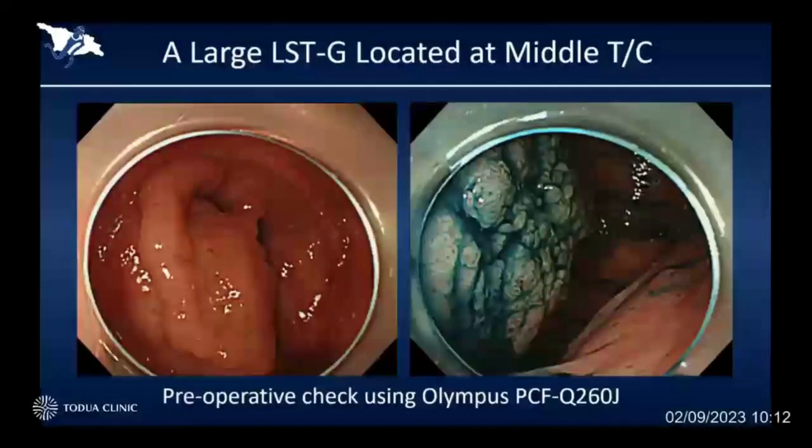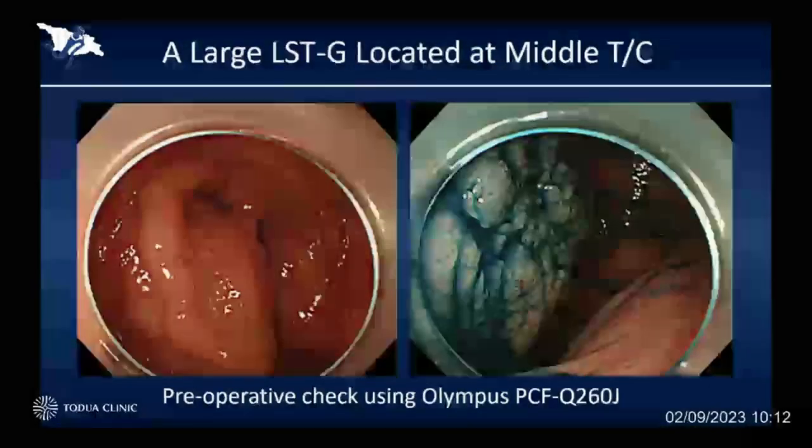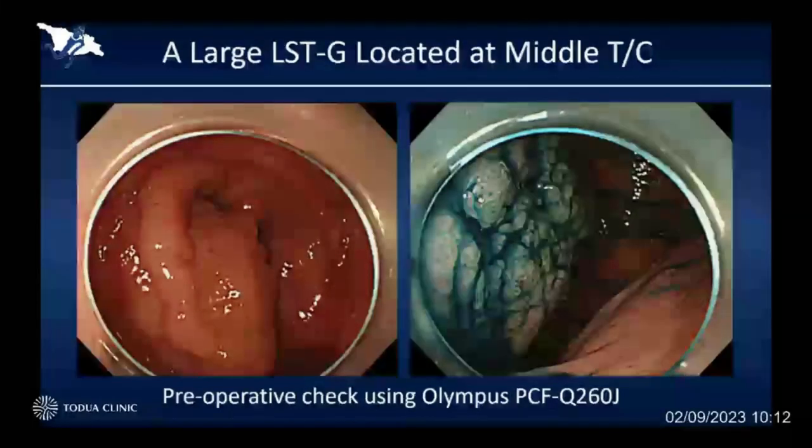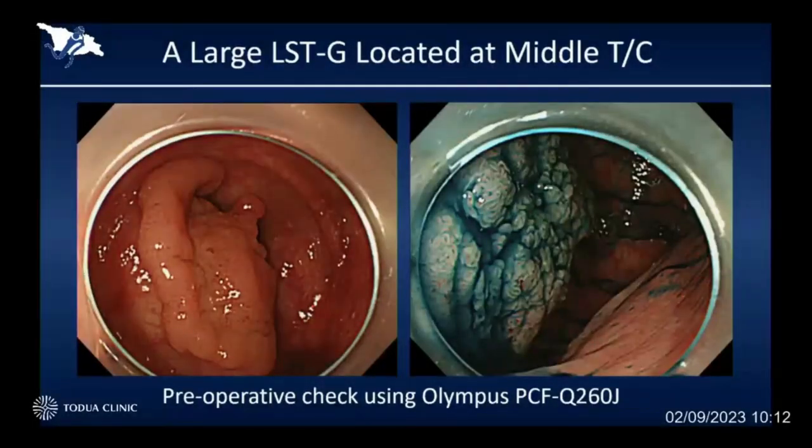I would like to show you some examples. This is a relatively large colonic laterally spreading tumor located at the middle of the transverse colon. I could go very close to the big lesion, but unfortunately, because of the severe adhesion, I couldn't go behind the lesion. That means I couldn't approach the target lesion for doing ESD.